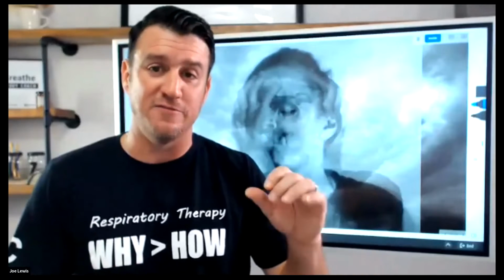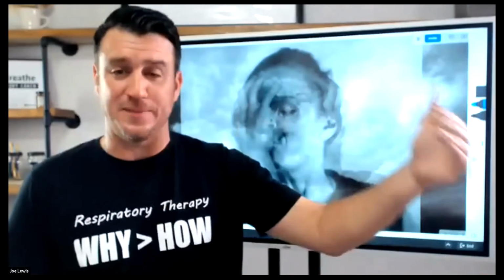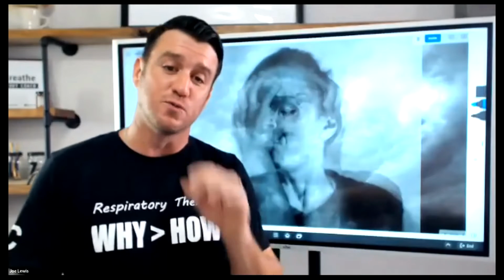So how do we assess our patients for adequacy of meeting their neural drive to breathe? Well, first things first, just like I talked about driving pressure, in the chat right now, how many of you routinely monitor occlusion pressure? This is the P100. Go ahead and put it in there. How many of you monitor it routinely and document it routinely?